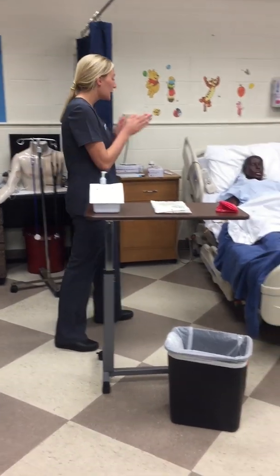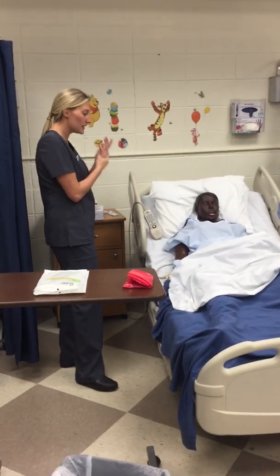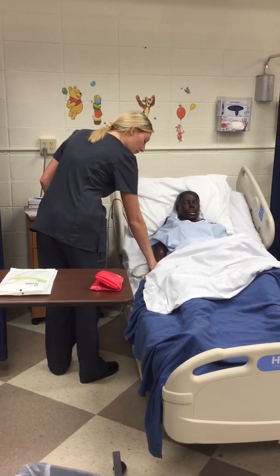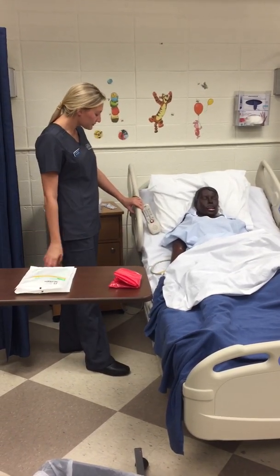Hello, Mr. Jones. My name is Paige. I'm going to be a nursing student today. We are going to be doing a dressing change. You could give me your name and date of birth. Okay, perfect. I'm going to go ahead and raise you up.